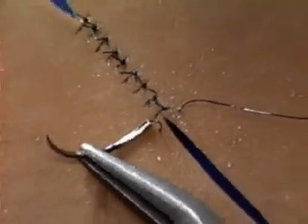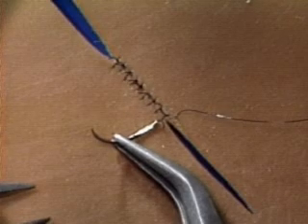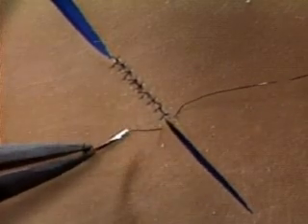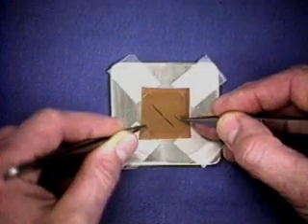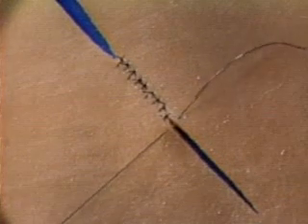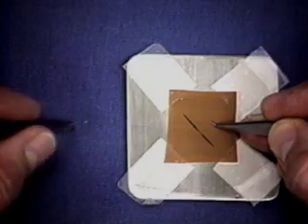Once you've got the needle through, you no longer need high magnification. In fact, it would be quite a nuisance to continue with it. Turn the magnification down before continuing. Now, to pull the thread through, pass the needle to your left hand forceps and make a long, steady movement with the left hand while carefully watching for the end of the thread. When the end comes into view, stop pulling and drop the needle. Where it lands doesn't matter, as you'll see when we've tied the knot.